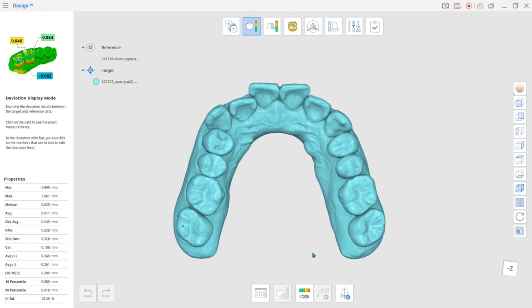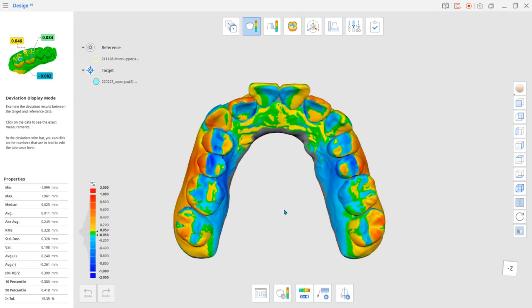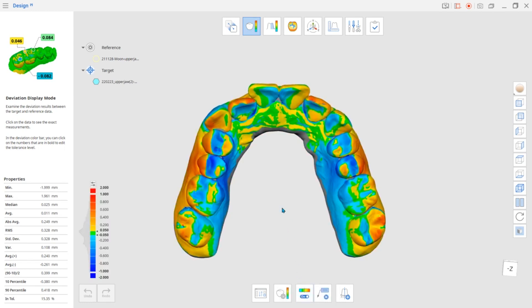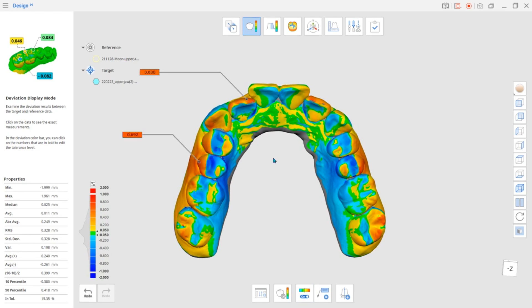Turn on Color Map at the bottom and move your mouse along the data to see the exact measurements. You can create an annotation with the exact deviation measurement result by clicking on the data.